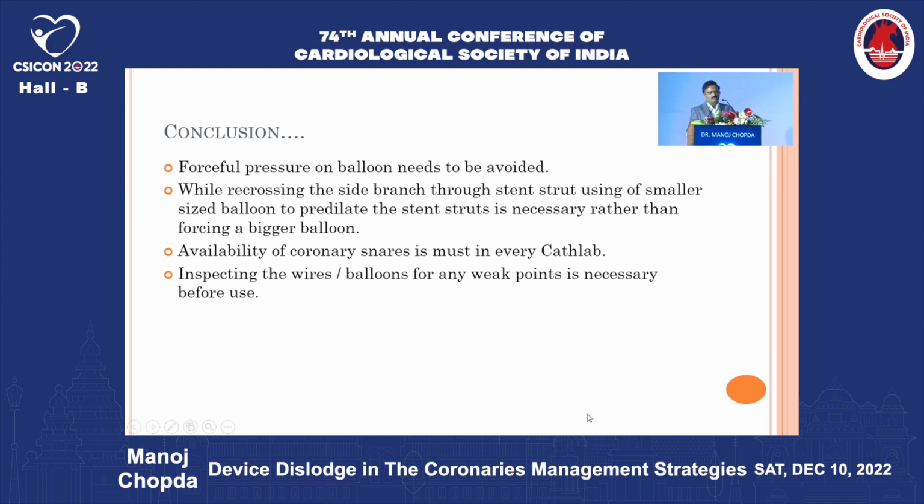Forceful pressure on the balloon needs to be avoided while recrossing the side branch through the stent strut. If you try to push a bigger balloon and it's not going, this can create problems.